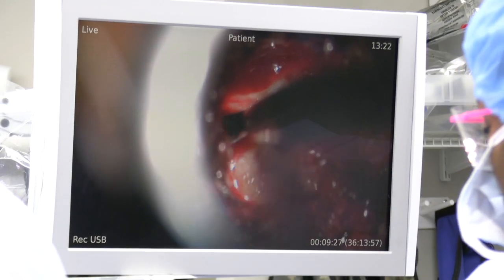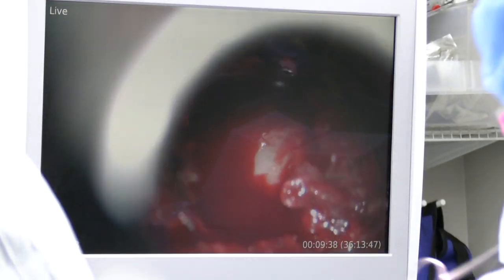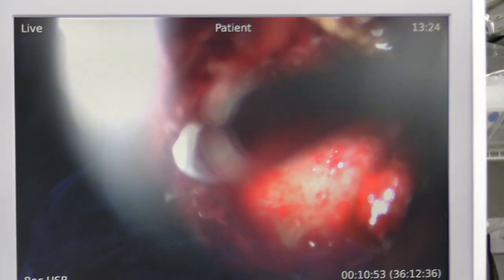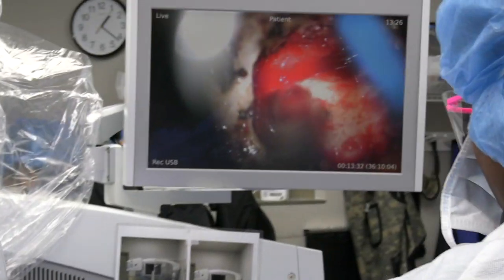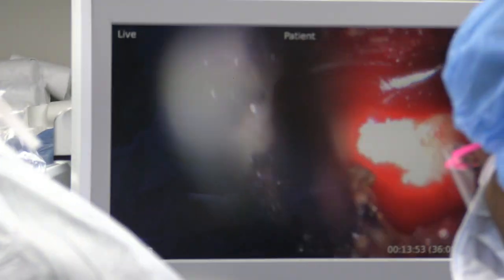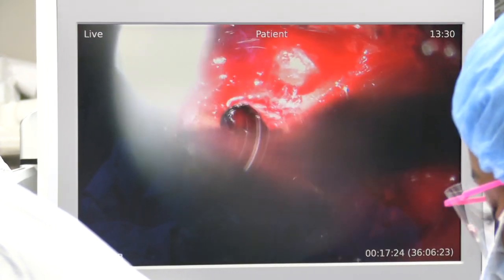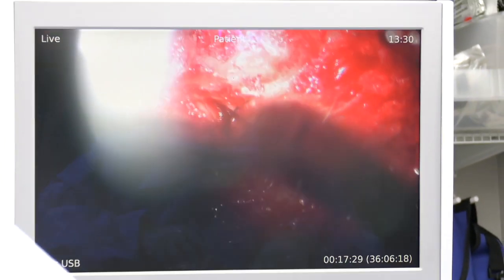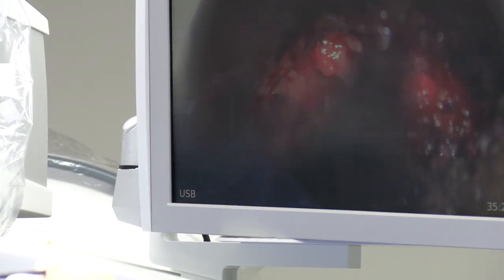Just go a little more towards the head here, and you see that by just repositioning the scope it kind of opens up a little bit more exposure without having to take a bigger incision. Again, lamina to the spinous process right here. The flavum where it detaches from the undersurface — I just need to detach it by getting under this bone here, which is the lateral recess and facet area. This is the flavum, mostly ligamentum flavum in the lateral recess on the right side, just trying to get lateral to the dura on the right.